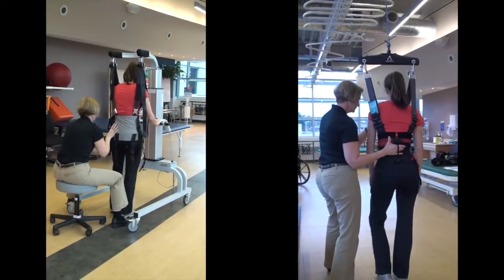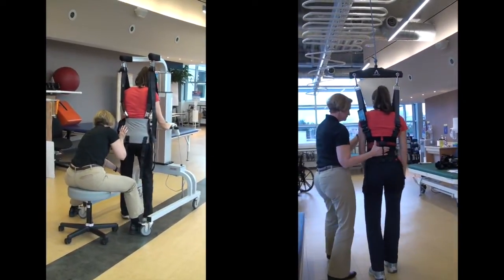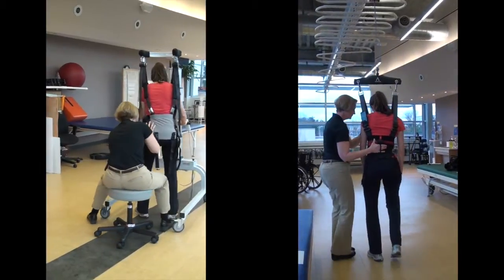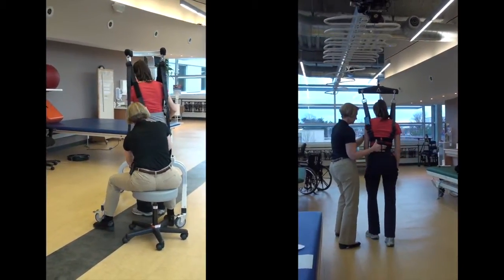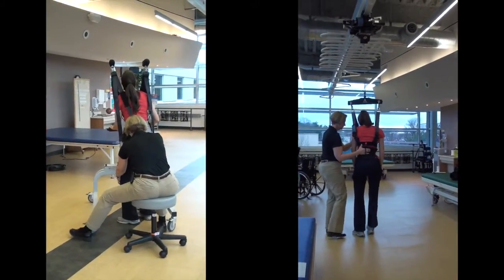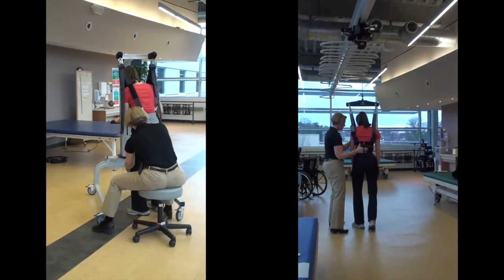In Zero-G, the patient is secured by a harness to the Zero-G robot as it rides along the overhead track, monitoring their movements. And with no barriers between the therapist and patient, hands-on interaction is encouraged.